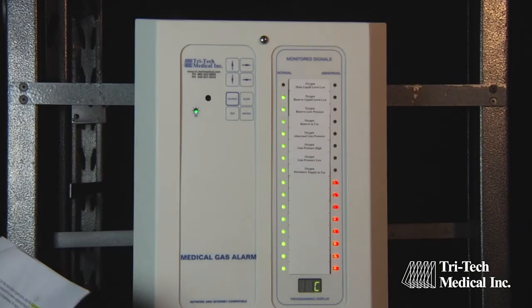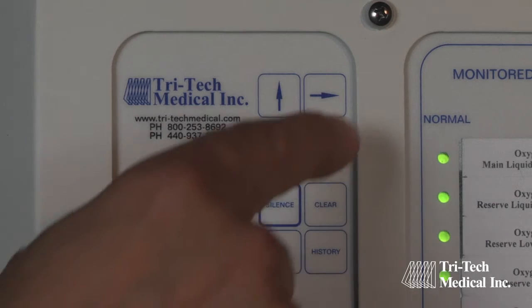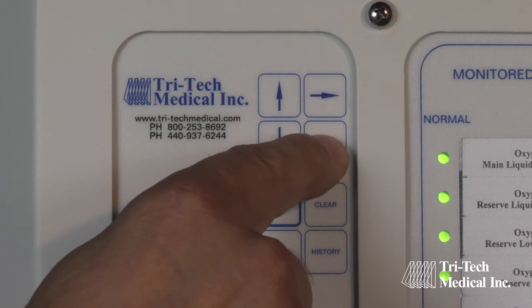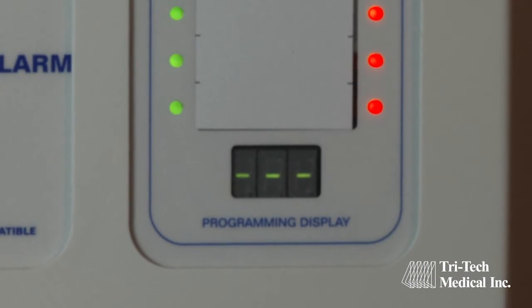To proceed to the next alarm signal point, press the right arrow button. Each of the subsequent signal points connected to source equipment should be programmed in the same manner. As each signal point is programmed, be sure to press the left arrow button to save each change as it is made.